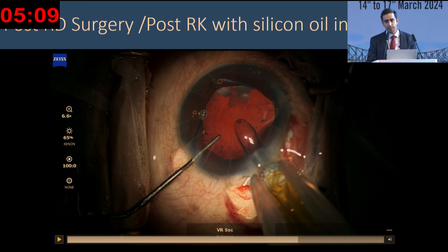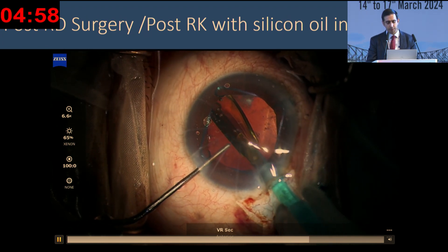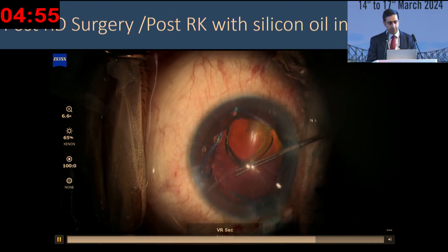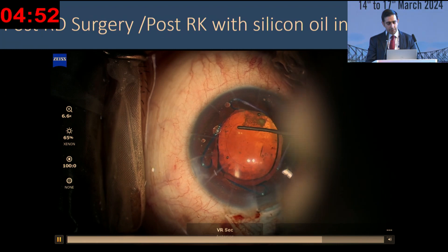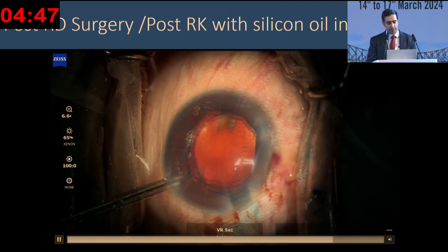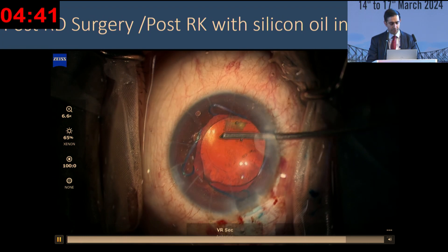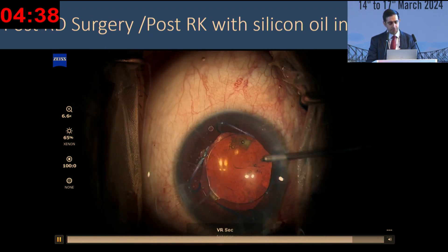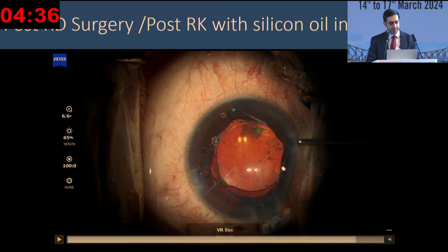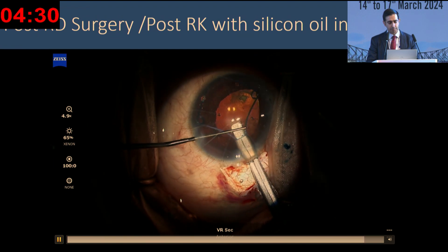I prefer to go into the wound rather than wound-assisted into the bag, and then implant. This is the Hoya IOL — no financial disclosure — which gives a more controlled delivery once inside the anterior chamber, and then gently dial the IOL into place. I realized there was a small flap of capsule, so I used the retinal scissors to create a nick there, and then with the micro-rhexis forceps enlarged the capsular opening so that it would not go into phimosis later.